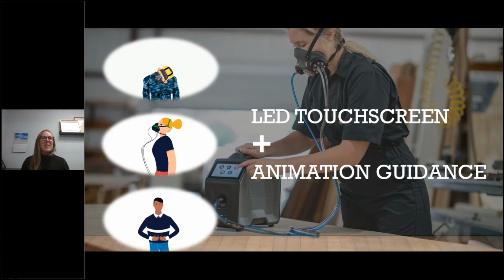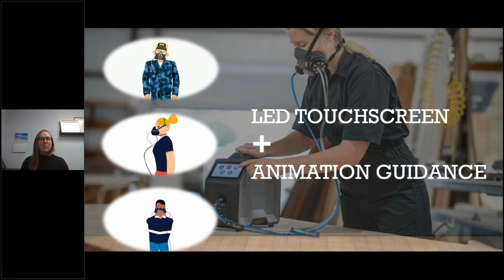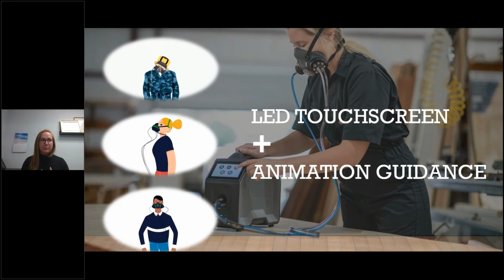But the benefit to me of these on-screen animations is the guidance they help provide the user if you as the fit test administrator are keeping your distance. I would say when I used to go out and give fit tests, I would be very descriptive, and I was having to basically perform the exercise for the person just because I wanted to have that clarity. Well, now a lot of that is coming from these avatars.